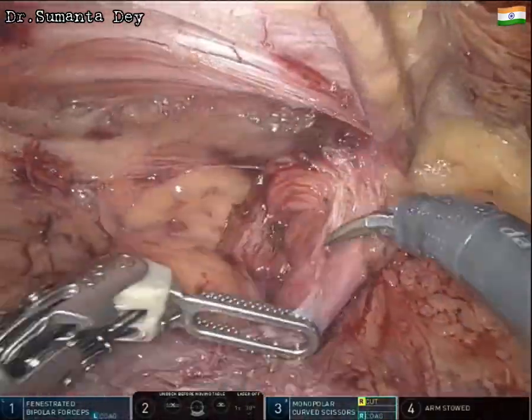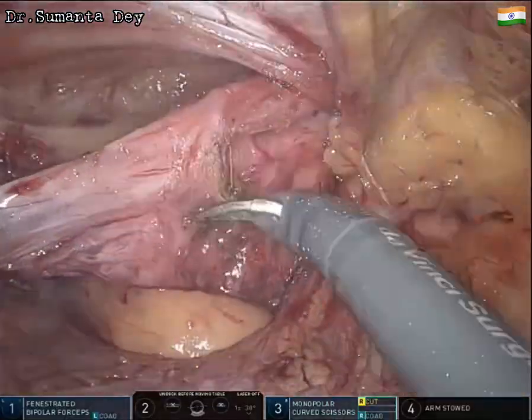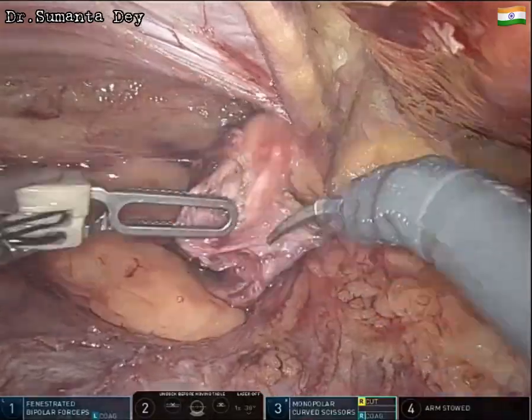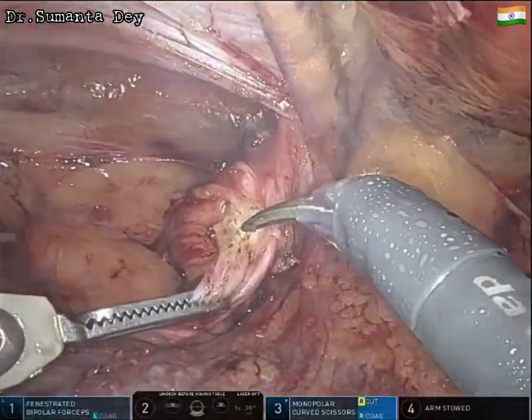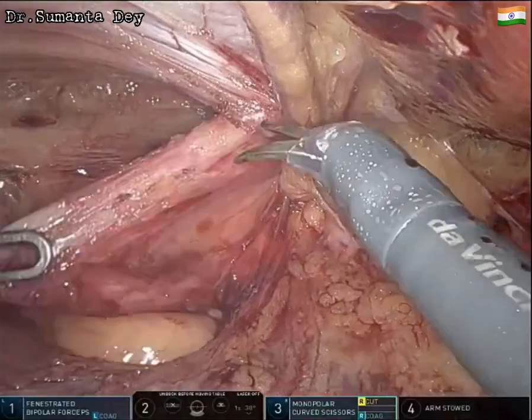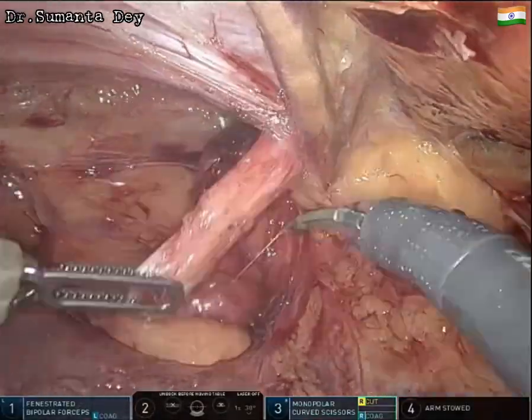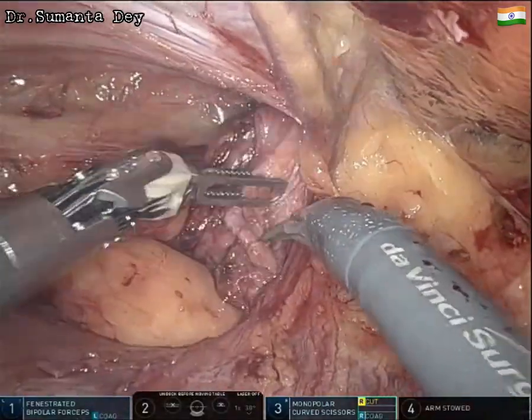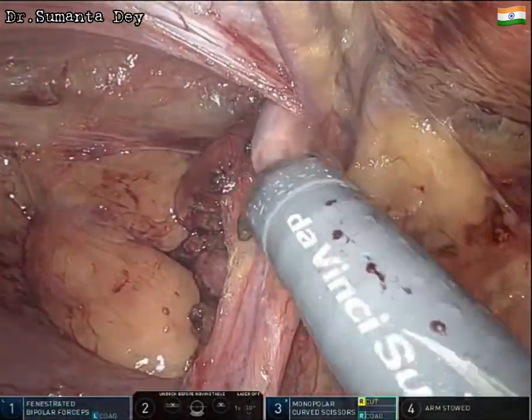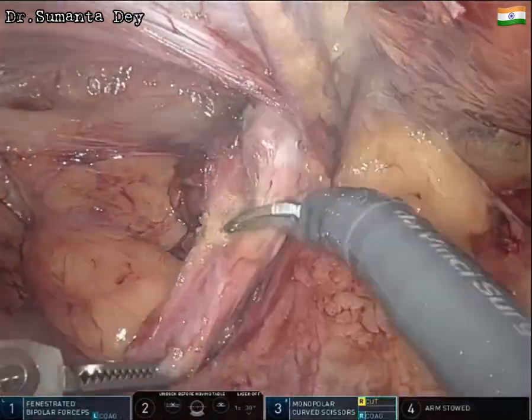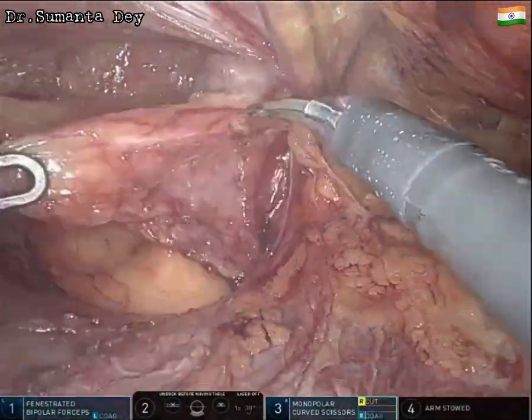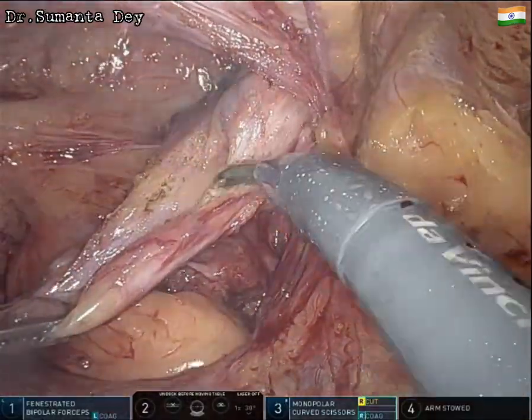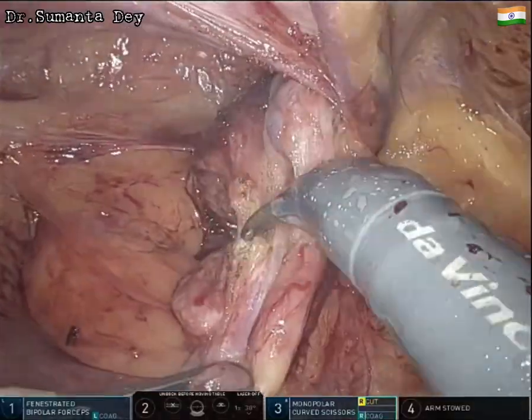Moving to the distal aspect of the sac, it is assessed how far the sac extends down into the scrotum. The sac is pulled while dividing all its attachments to the cord structures. The testis is gradually seen coming along with the sac. Because this is a complete sac, the sac must be divided at this level.